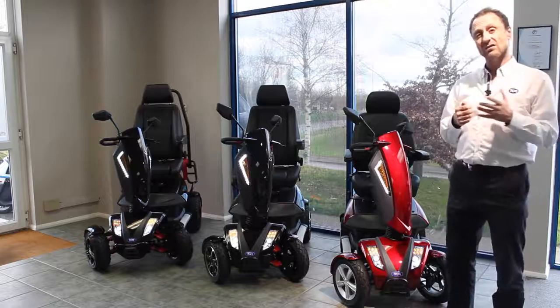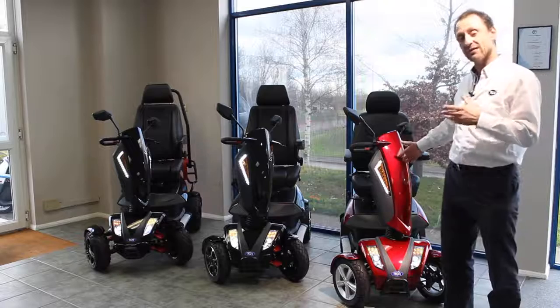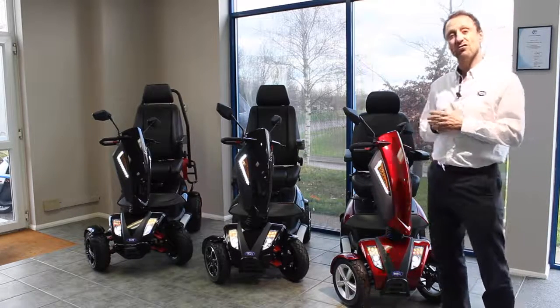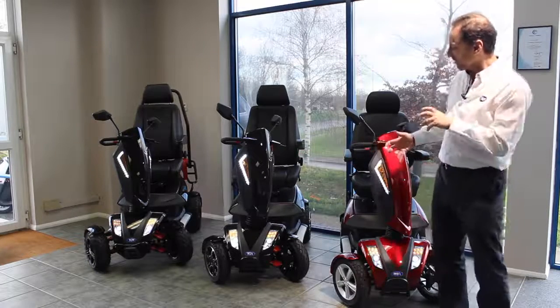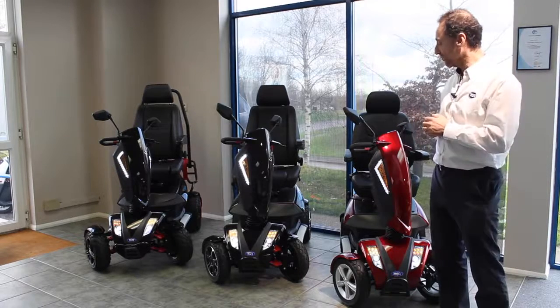There are three models in the range. There's the Vita 4, which is available in a really vibrant metallic red, an orange and a white as well. Then moving up the range onto the Sport, it's got some nice little features. The red on the suspension just comes out a bit, as does the stitching on the seat. The seat is also a little more moulded, so a bit more supportive.